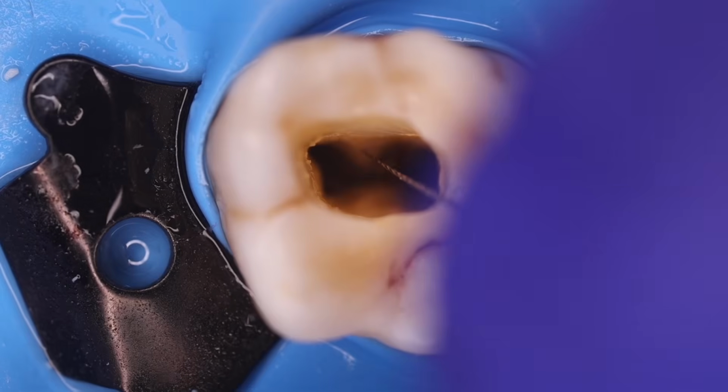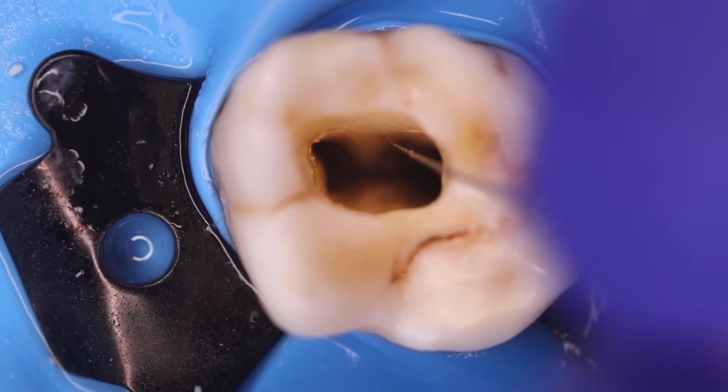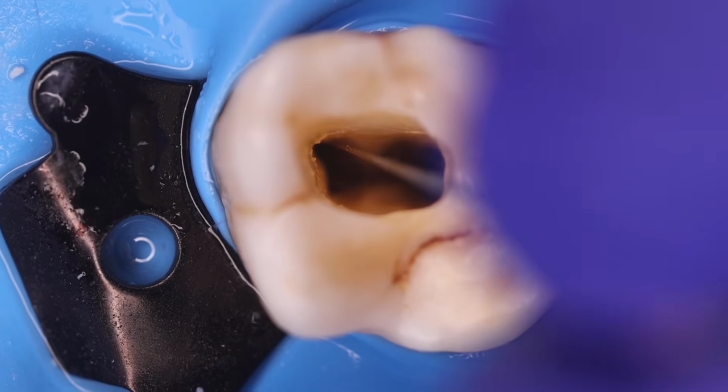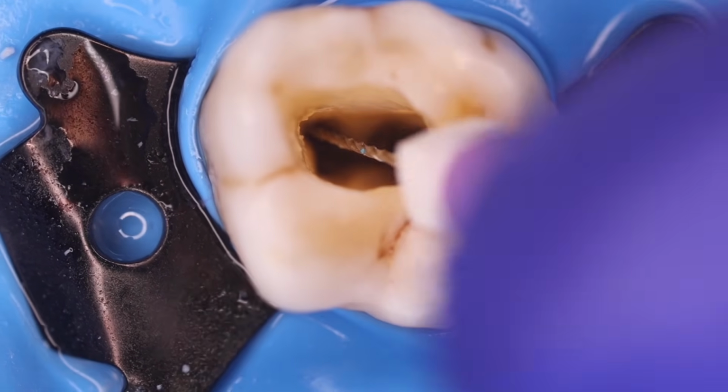Then exploring the mesiobuccal canal MB1, yes, we are able to have the file going into that mesiobuccal aspect.